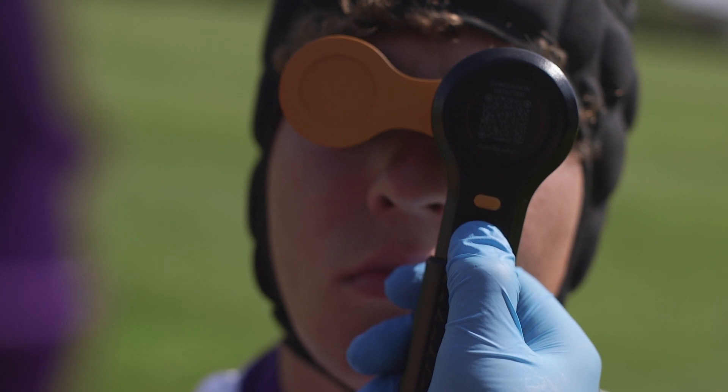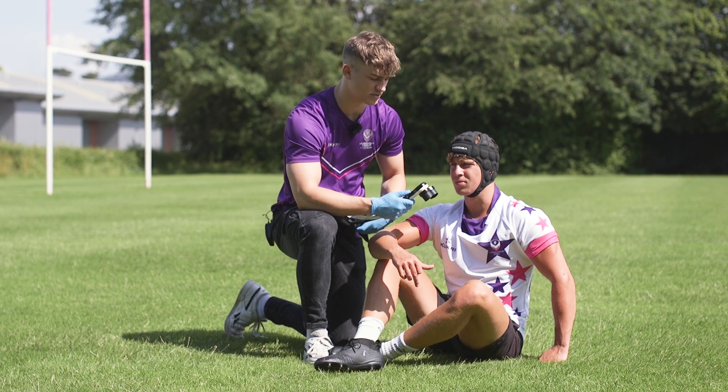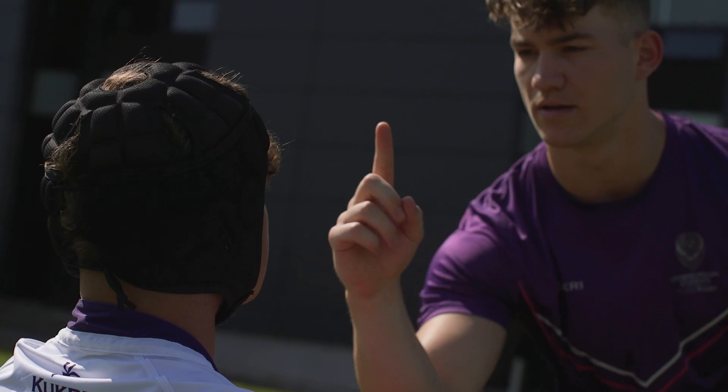Once the device has finished the test, it will give you a result: a pass if it's a normal pupil response, and a fail if it's an abnormal pupil response compared to the player's baseline.